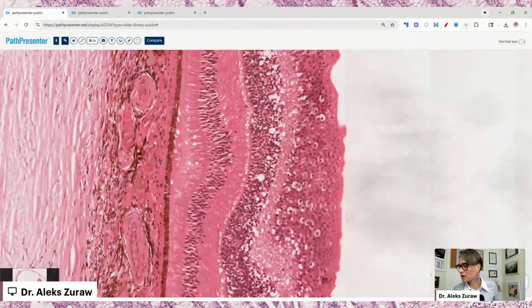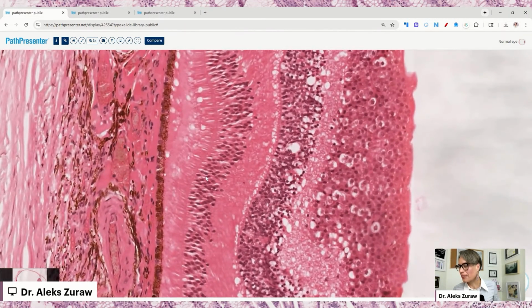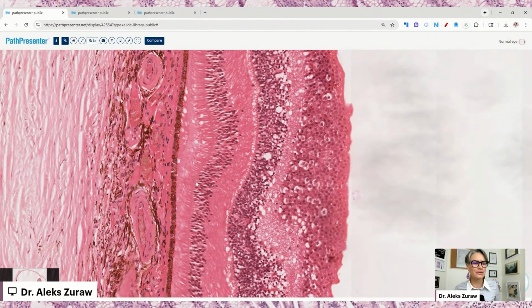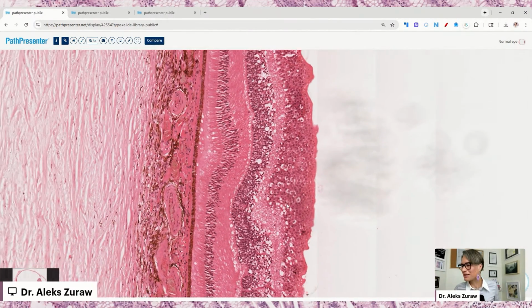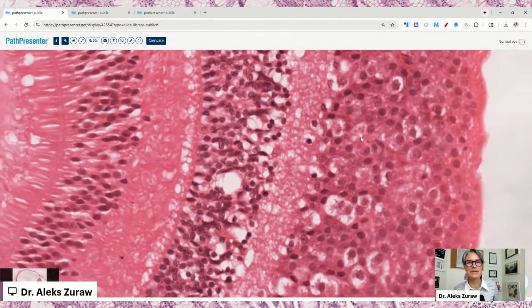So let's see if I can even count 10. We have the RPE, 1, 2, 3, 4, 5, 6, 7. Okay, I see 7. But there are also membranes. Maybe 1, 2, 3, 4, 5, 6, 7, 8, 9, 10. Okay, so these membranes count as well. So yeah, I guess I need to do a separate live stream on the retina and go super deep in.